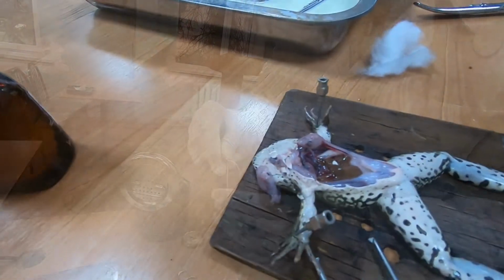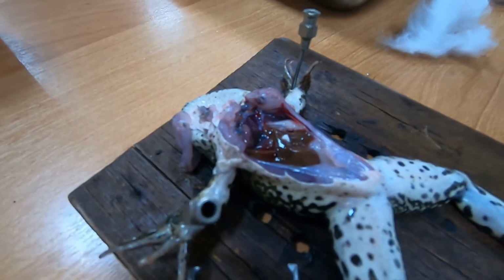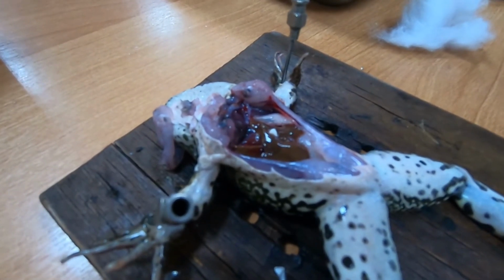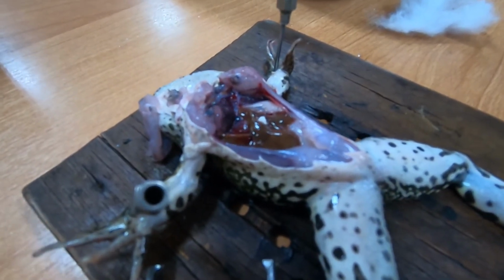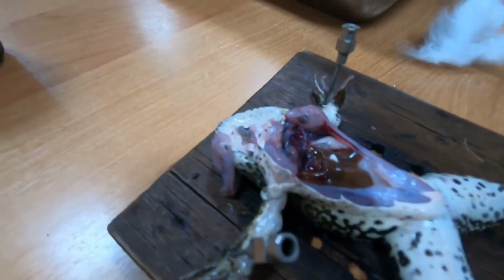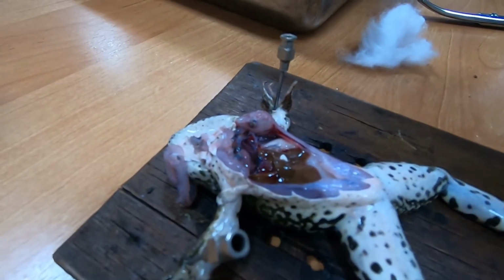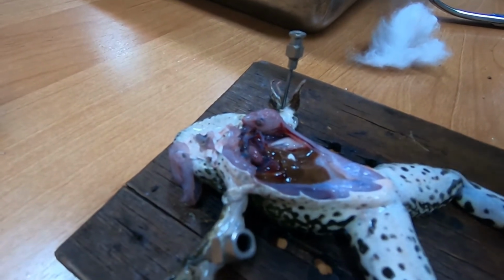That's how we do it. You can see how the heart is beating here. This is what we call heartbeat. So we're going to fix our thread or ligature at the side of where we have the pulmonary artery and the pulmonary vein. Have a look at it.